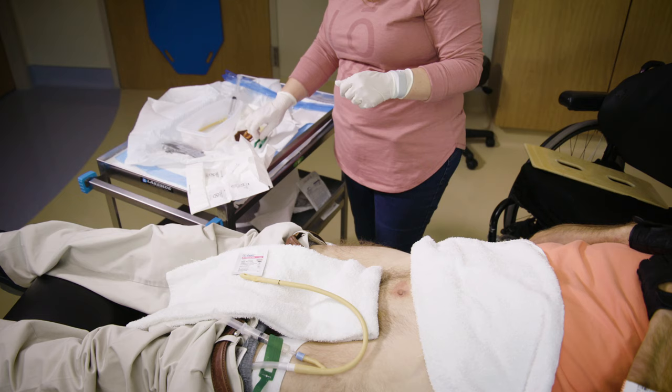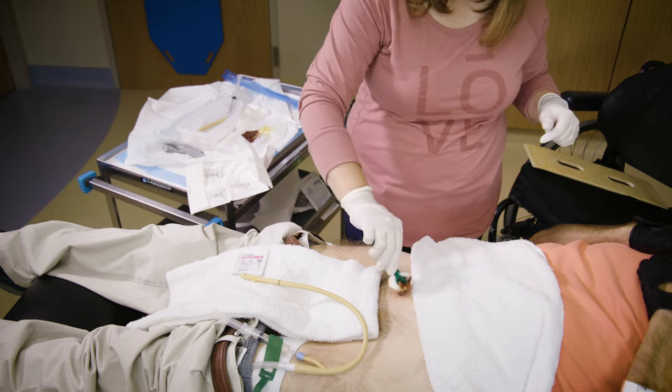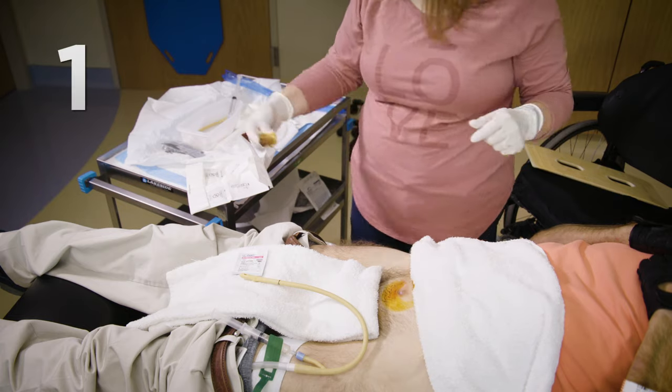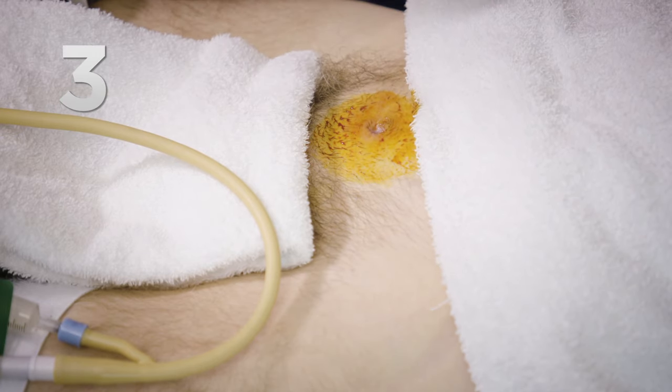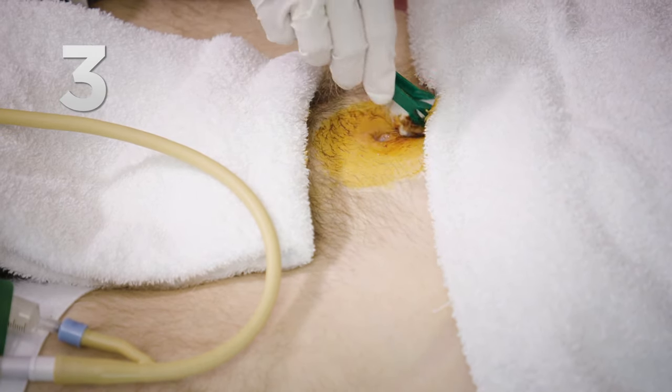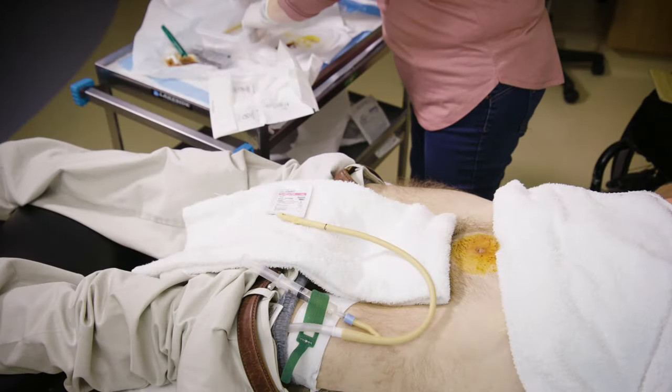There are a pair of tweezers included in the kit. Use the tweezers to grab one of the saturated cotton balls. Clean the area in a circular motion, working from the insertion site to about two inches around the site. Repeat this three times. Once the area is clean, grab the tray and move it to the towel.